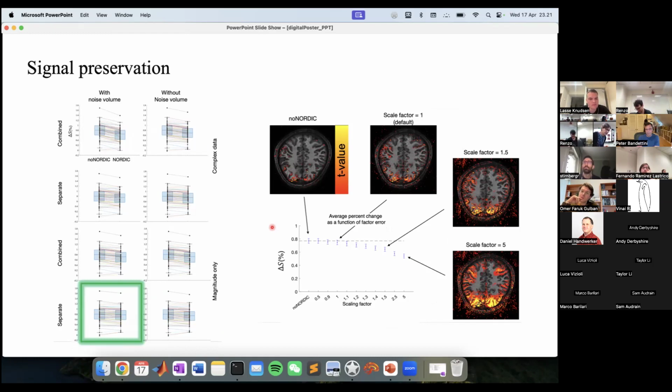It might be interesting in the future to also look at the rank of the reconstruction, because if you pushed the scaling factor all the way to the point where the rank was 1, that would be the equivalent of only looking at the global signal, as everything is just one time series combined. That might be really useful for people to understand what it is doing to the data literally, because it's an incremental quantitative reconstruction. Does that make sense, Lasse?